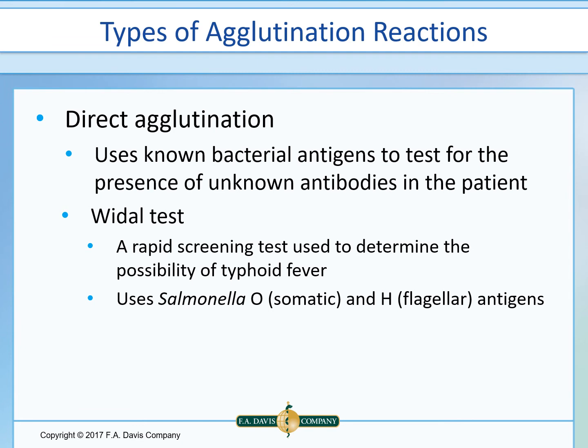Agglutination reactions are fairly easy to carry out. They don't necessarily require complicated equipment, and they can be performed as needed in the laboratory without having to batch specimens. There's various kits available for standard testing, so reagent preparation is minimal, and agglutination reactions are frequently used as serological testing, in which they can identify either antigen or antibody.